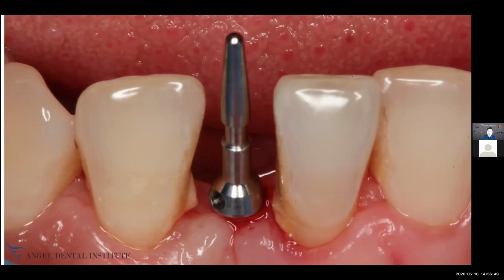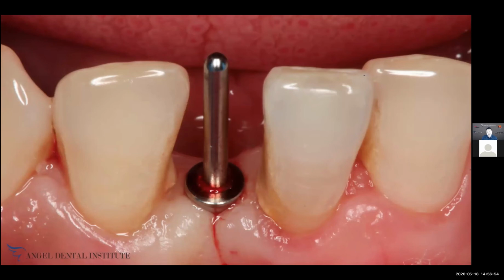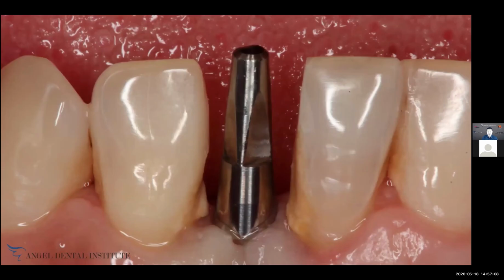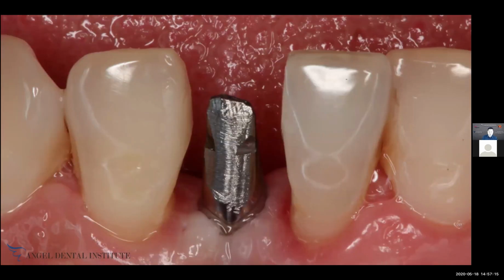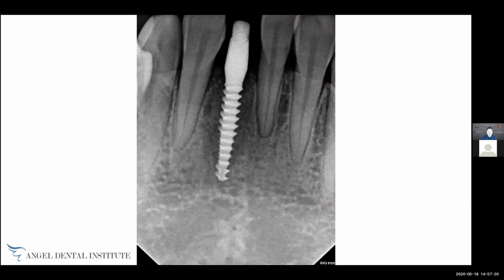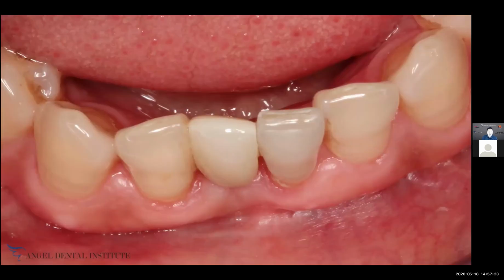After one drill through the tissue, I checked the parallel pin, I made it wider, flipped it over, checked again, put the implant in. It's a one body implant. So if you look at here, it's almost touching the adjacent tooth because the space is lost. Okay, so I did enamelplasty to give it room. Okay, and then after that, I prepped the abutment portion here, took an impression, and this is a final X-ray that day. 1 week later, delivered the final prosthesis.